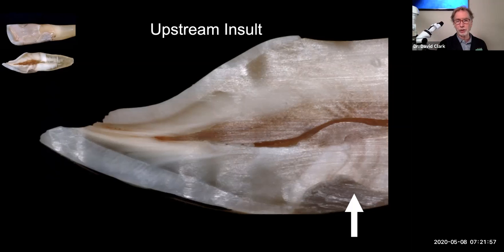You want to get a good peripheral seal, and with composite, we can have an infinity edge margin, leave just a thin layer of frank caries over the pulp, figure out where the pulp is, don't hit it, get a good seal at the DEJ, and then do additive dentistry and do an infinity edge, seal the decay, and let the pulp heal naturally. You win the game if the patient calls back the next day and says, I have no pain. If the patient has no pain, you were able to leave enough caries over the sensitive area that the pulp just goes on about its business and the pulp doesn't even know that you intervened. That's a really good indicator that you did well.